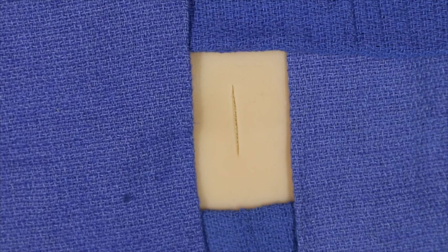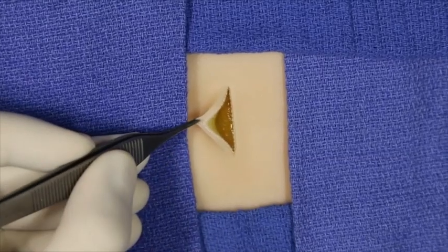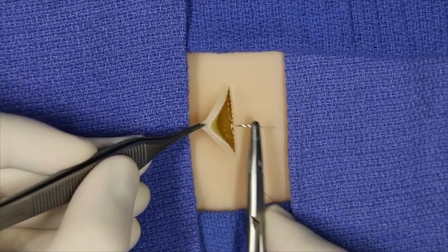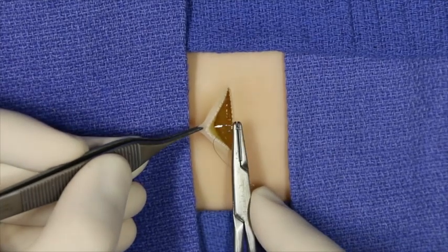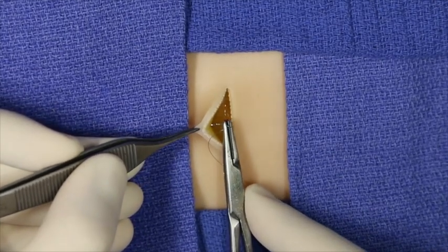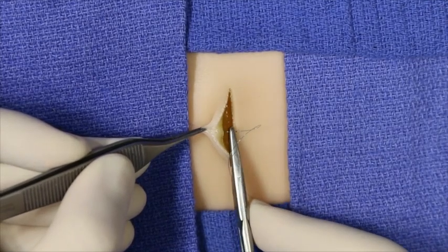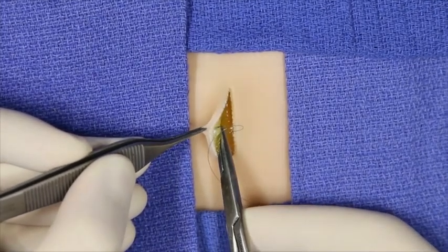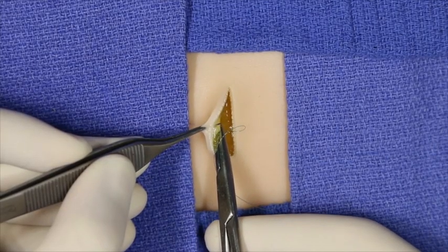The setback buried dermal suture is a workhorse technique. It is performed by reflecting back one edge of the wound. After effective undermining has been performed, the underside of the dermis is exposed. The needle is inserted at 90 degrees into the underside of the dermis and then exits again at the underside of the dermis. Note that the needle does not exit at the incised wound edge.